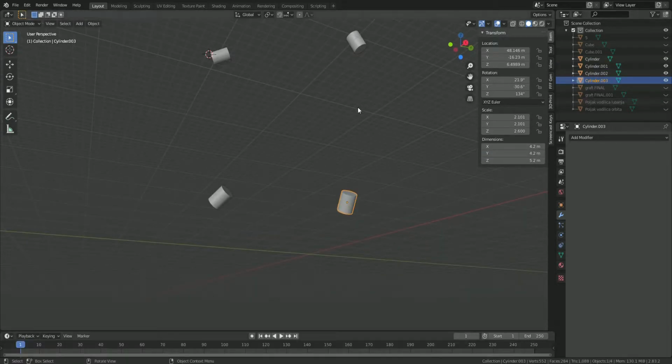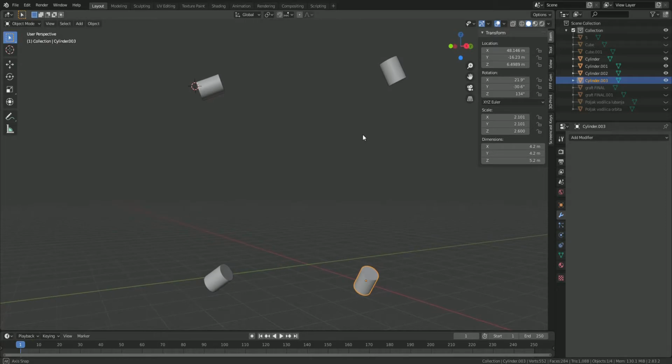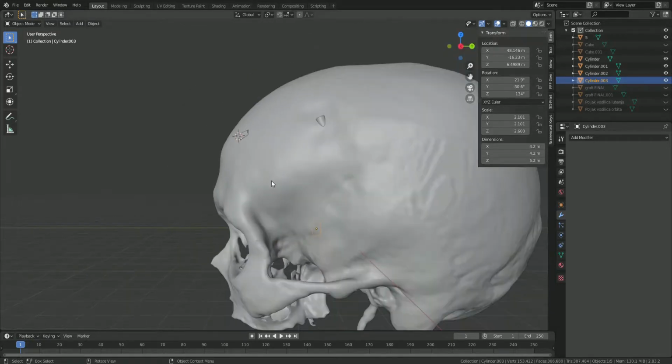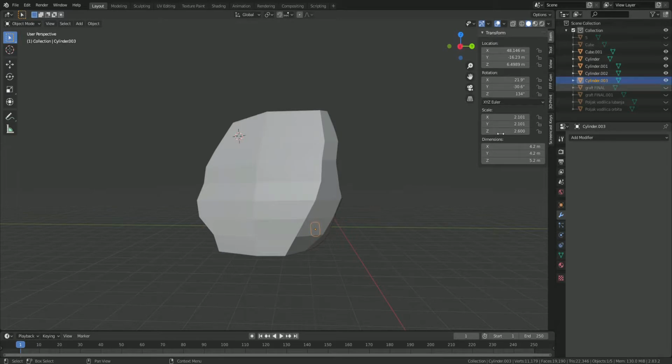But now this will be our outsource company with a Stratasys 3D printer. Maybe I could go on 0.1, but I'm not sure, so I just don't want to be, let's say, oh, sorry.